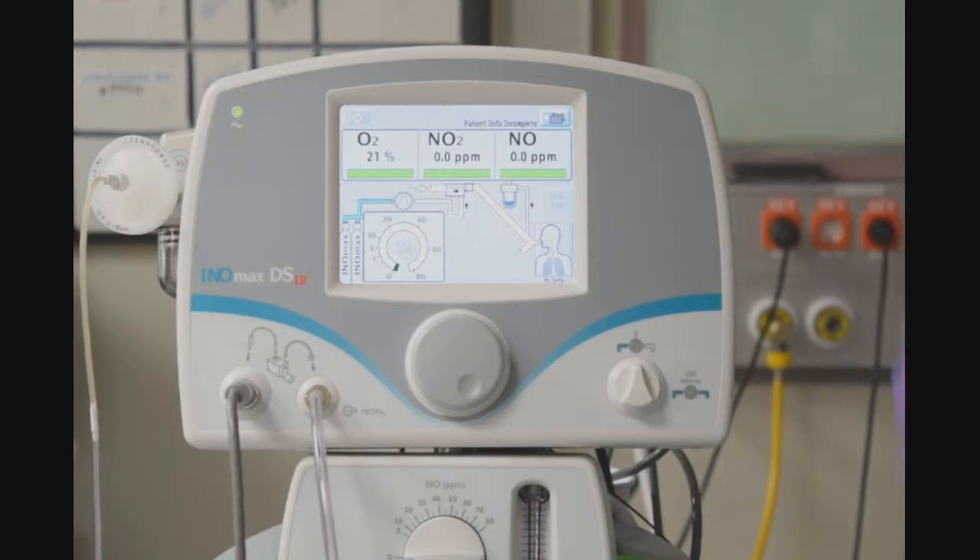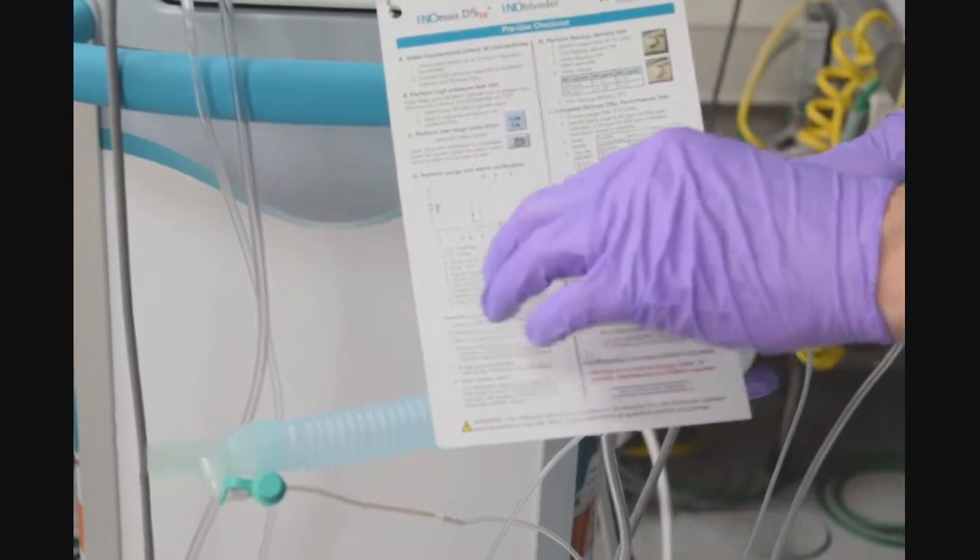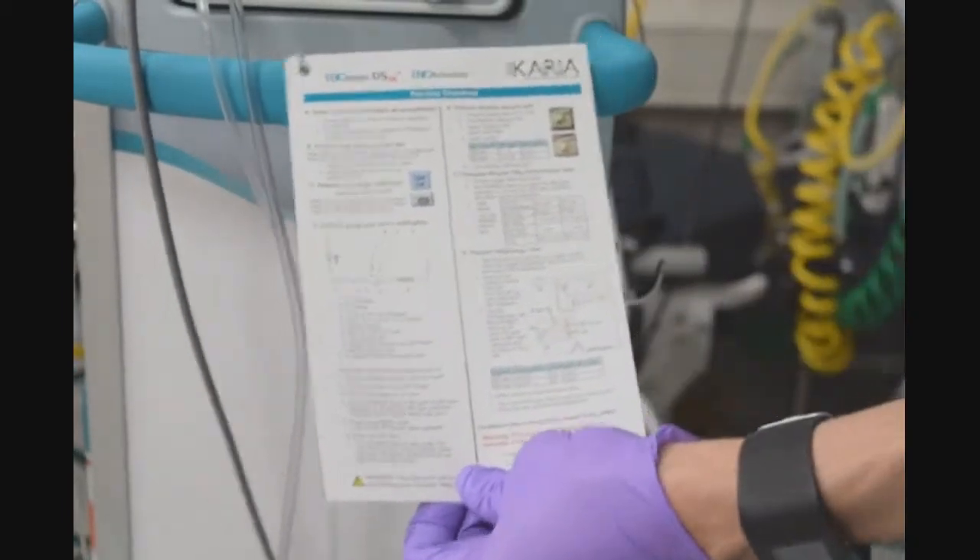Our low-range calibration is complete. Next step, I will perform purge and alarm verification. On the quick reference card, it clearly states the connectors or devices that you need to have in order to make your setup look like this.